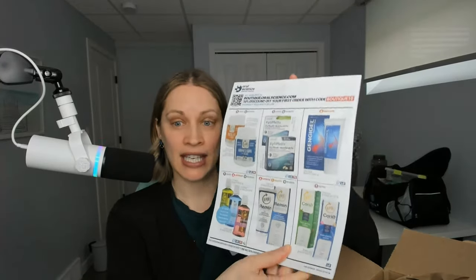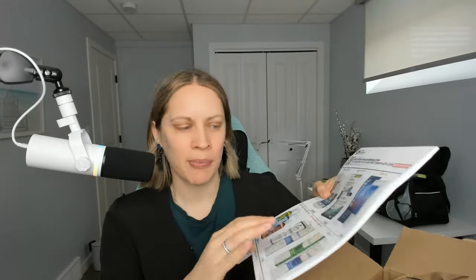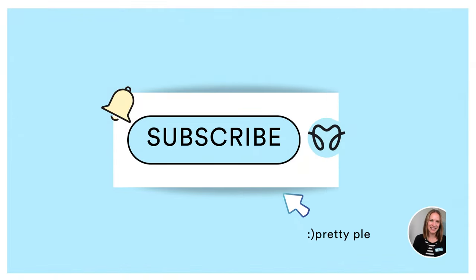I'm literally just opening it now. With Oral Science, if you order a certain amount you can get these included — it's just kind of like a pad. If you recommend something to patients you can circle it and then they can purchase it online themselves, so I do always get a bunch of these when I place an order.